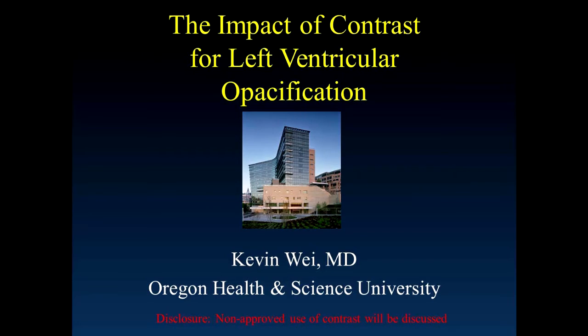I would like to make a disclosure for this presentation and let you know that I will be discussing myocardial perfusion imaging briefly, which is a non-approved use of contrast.